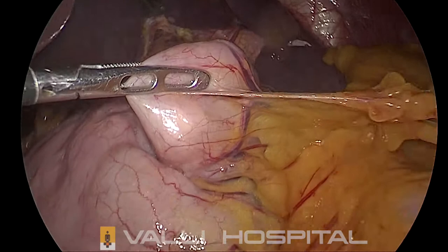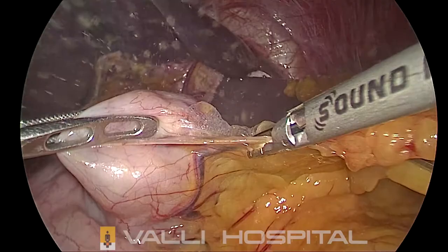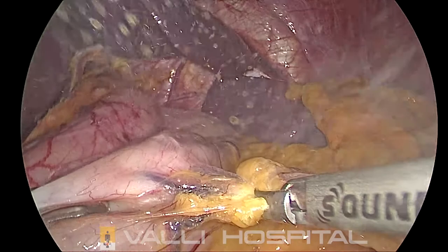Now we are going to divide the short gastrics. We usually divide the proximal 2 to 3 short gastrics. The assistant has to hold the fat and the surgeon has to hold the stomach and divide in between until you see the window.